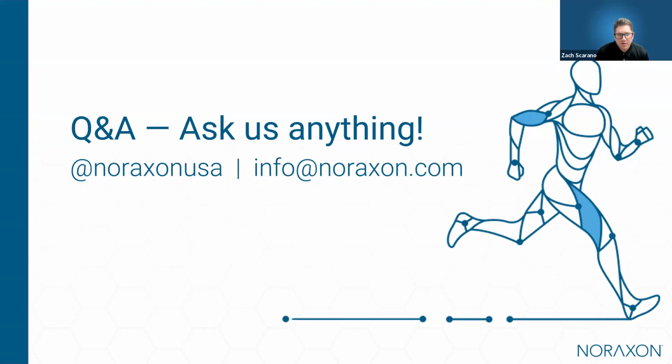So all of our devices are certified medical devices, and so they have to pass certain quality and safety standards in order to be registered as those devices. So happy to provide that information. It's available on our website as well. And then otherwise, definitely encourage you to just search for Noraxon systems in whatever research articles are most applicable to the application that you're looking to address.